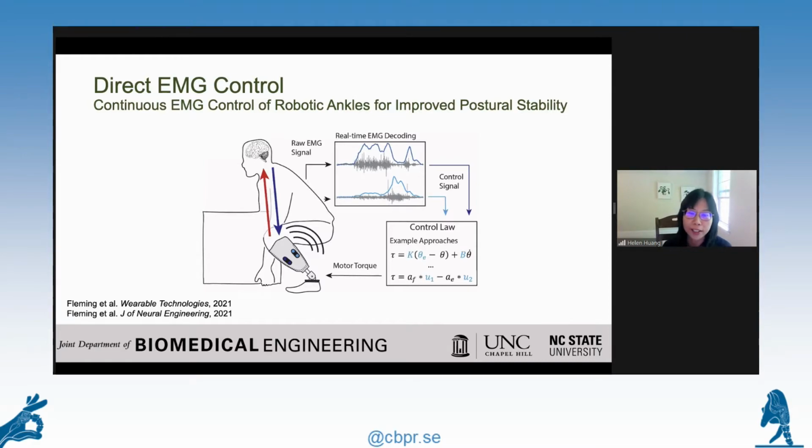So now come back to, what if, purely for this task, some user just wants to lift up a heavy box, right? So how do we control the prosthetic ankle? If we think about autonomy, you need to understand the user's state and also the environment, like how heavy the box is, what the compliance of the ground surface is that the person is standing on. It's just a very challenging control.